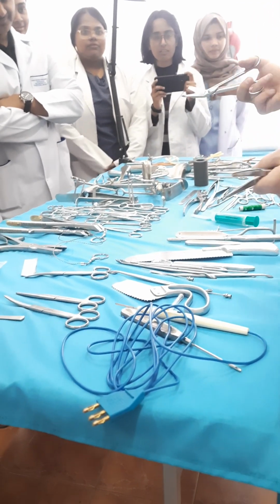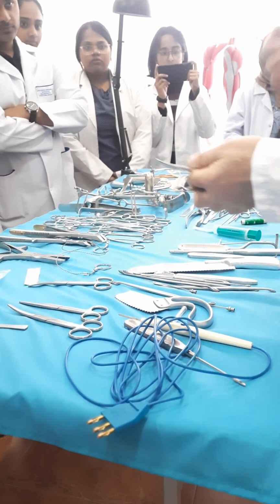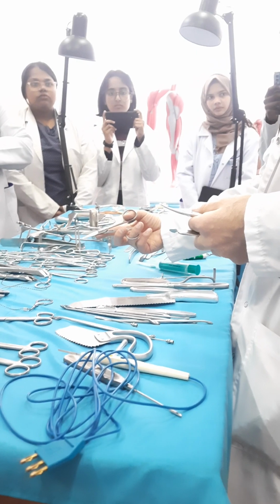Okay, no problem. Now, angular and curved instruments we use for deep structures. Remember, please, a straight instrument is used for the surface. Otherwise, if you try to cut deep structures with a straight instrument, you must insert your hand.